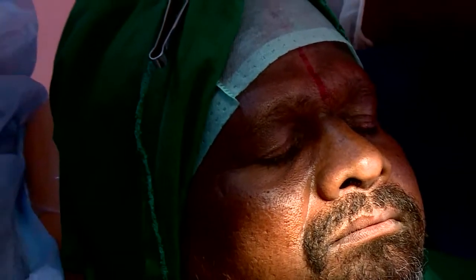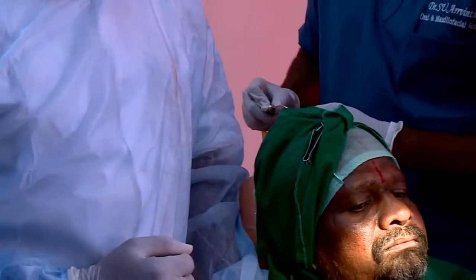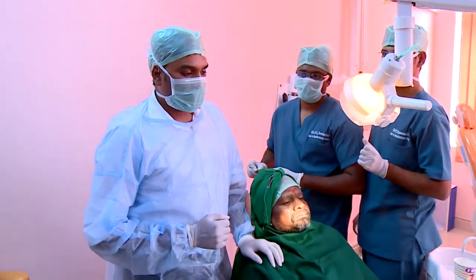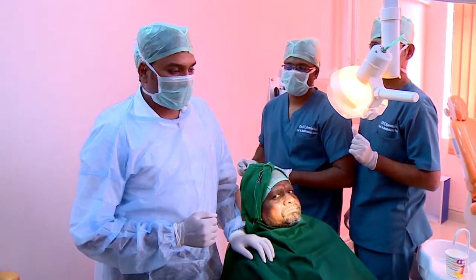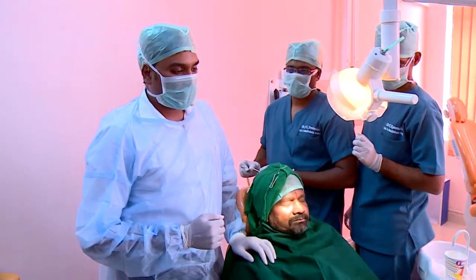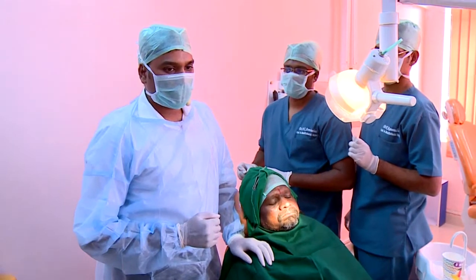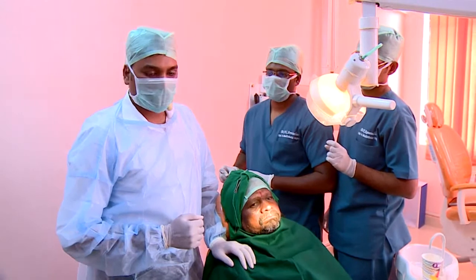Okay, the second step is surgically scrubbing the area. This is important because the patient might have a superficial added infection, say a candidal infection or a bacterial infection. We don't want that to be included in our biopsy specimen. So thoroughly scrub the area and then go ahead with the biopsy. The third step is checking for pain, whether the patient is comfortable or not. Following that, we can go ahead with an incisional biopsy, where we take a wedge of tissue involving the mucosa, submucosa until the muscle layer, including a portion of normal mucosa also.